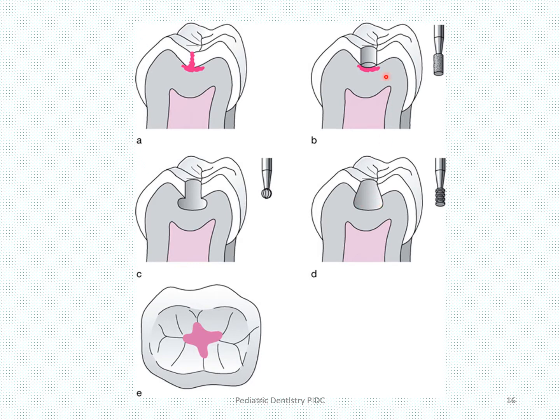All right, most of the time we tend to forget, we do incomplete caries preparation on the lateral walls and do a fantastic job at the bottom, and then we restore, and then we have marginal leakage because the caries has not been excavated properly from the lateral walls, and then the micro leakage begins. Okay, so step number 1 is to get the lateral walls caries free. Then try to remove things from the DE junction, and why and how we do, we will discuss when we are actually discussing a few slides later.